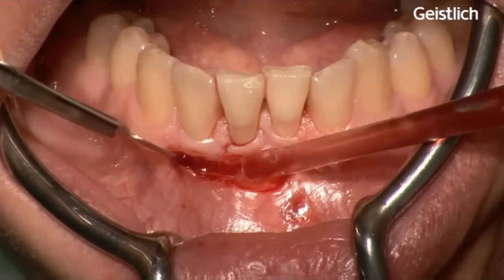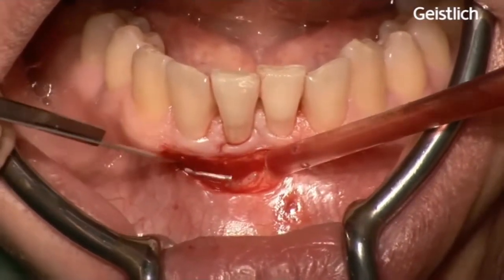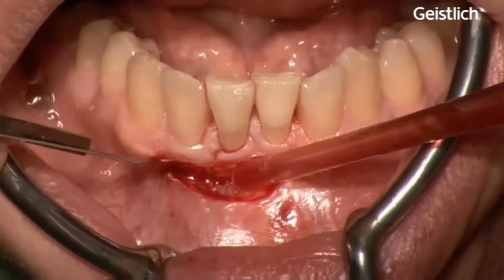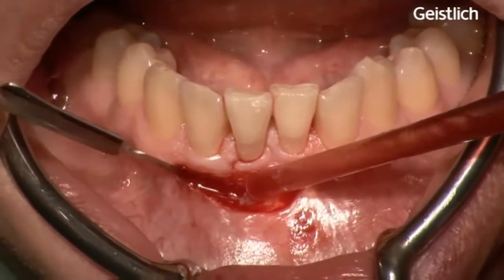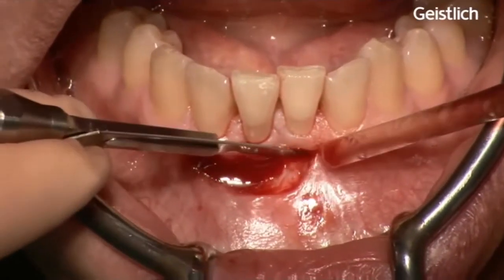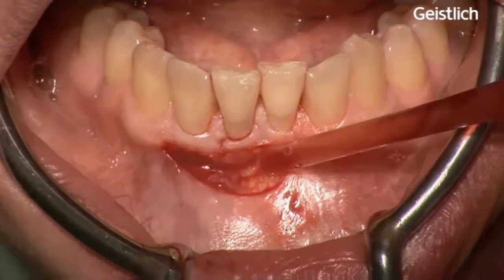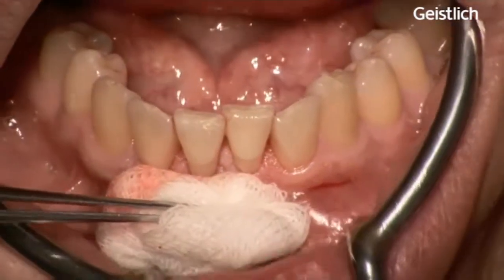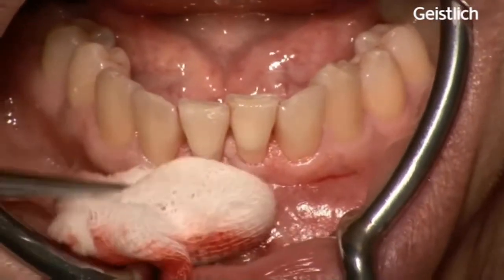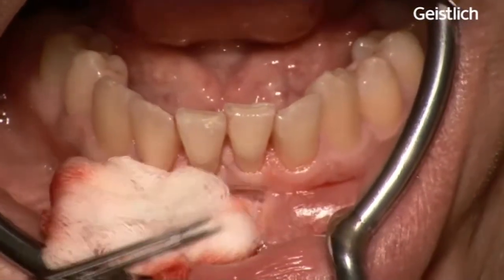To permit the apical advancement of the flap, eventually some muscle insertions have to be eliminated. The blunt dissection is extended laterally to such an extent that the flap stays tension-free when positioned apically to the level of the desired width of keratinized gingiva.